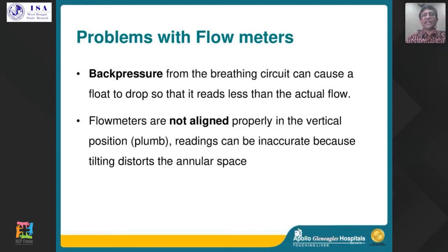And if the flow meter is not upright, or not aligned properly, it will give you an erroneous position, because then the physics will not work properly.